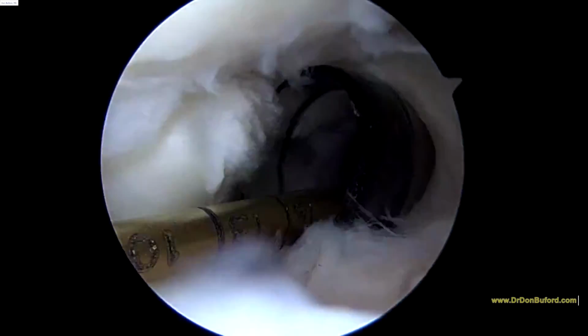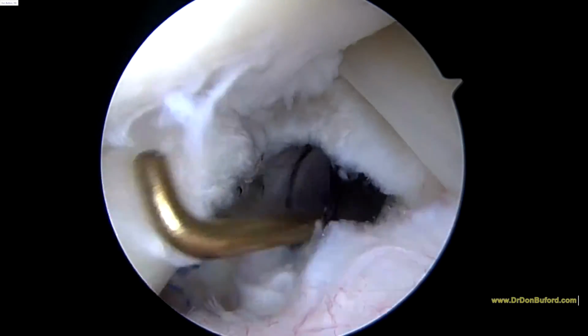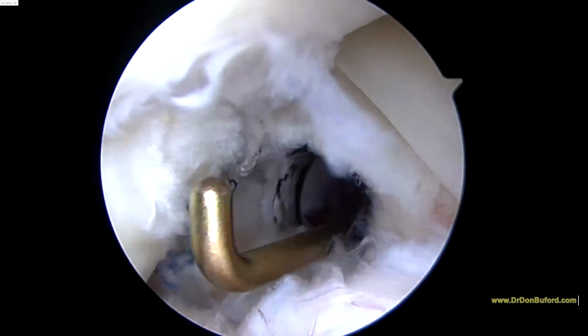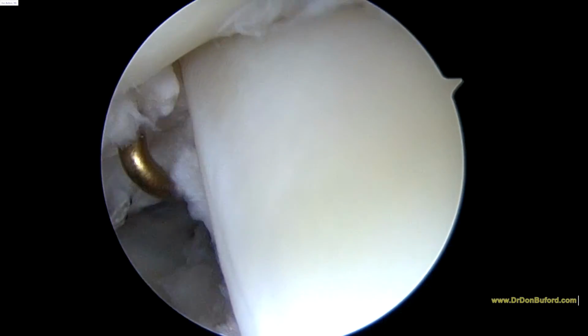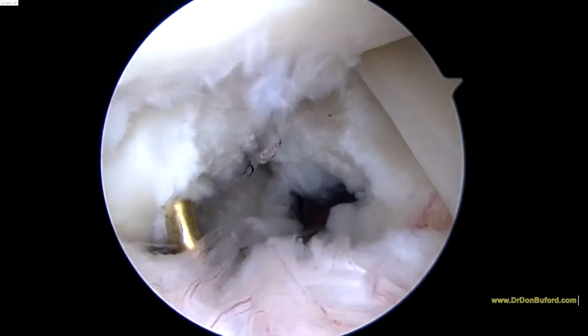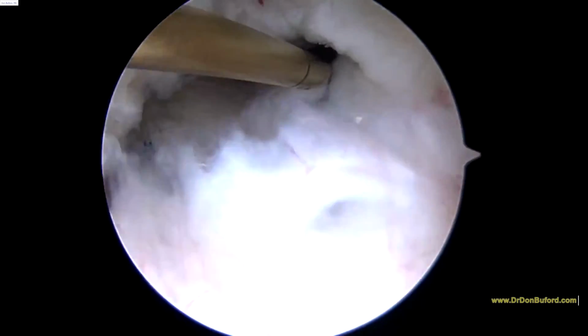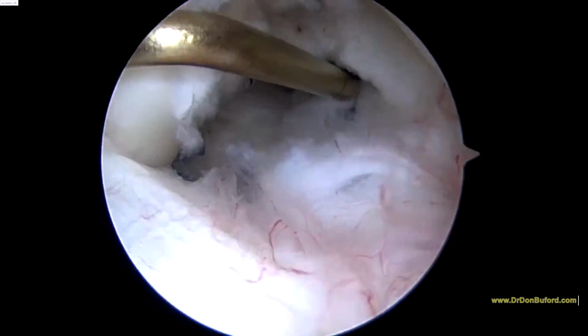You can go back on the video and look at where we started, but now this subscap is running up in the right direction. And I think we've got it anchored down to this insertion right up here where the probe is going. That's where the anchor is. And so we're going to stop there. I'm going to come back around and we're going to look at the biceps now, because we've still got that biceps issue to deal with.